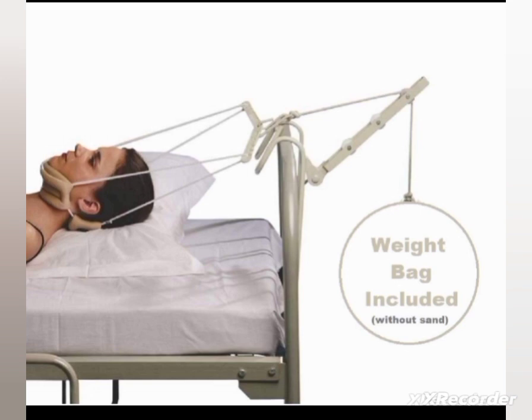The patient may be in low or high Fowler's position depending on the purpose of the traction. It can be removed when the patient is sleeping, and it can be used at home also. So the cervical head halter is commonly used in degenerative disorders or to relieve muscle spasm.